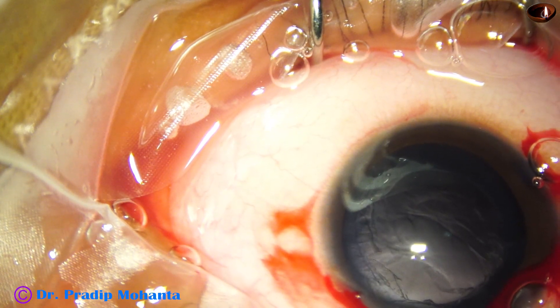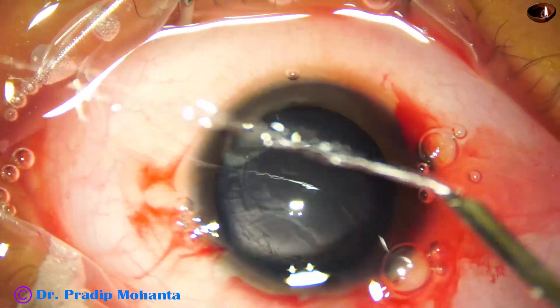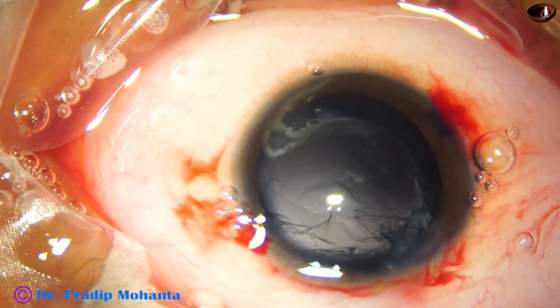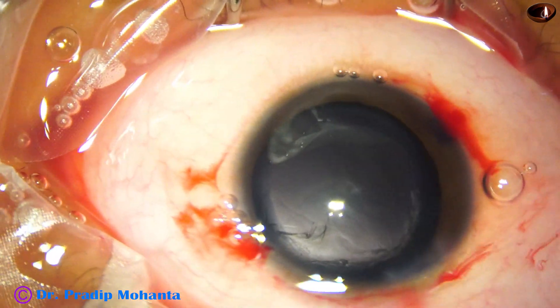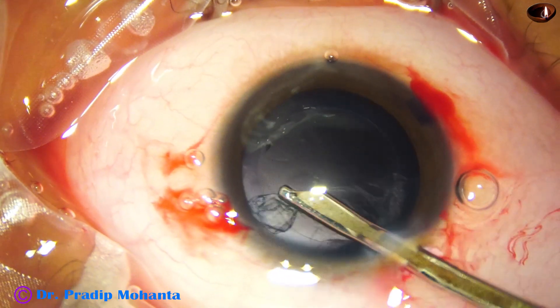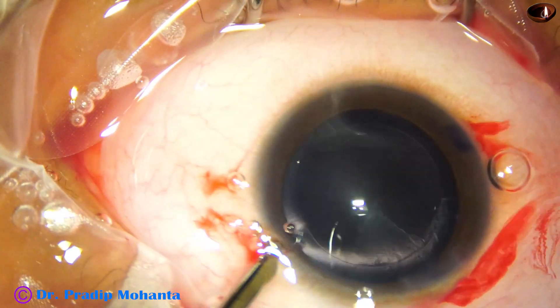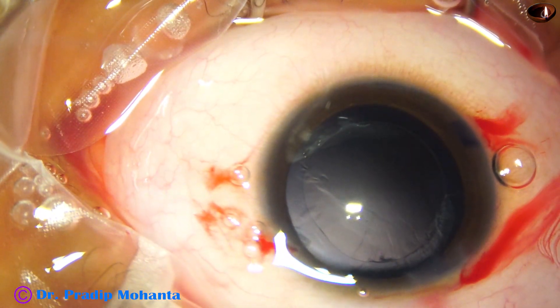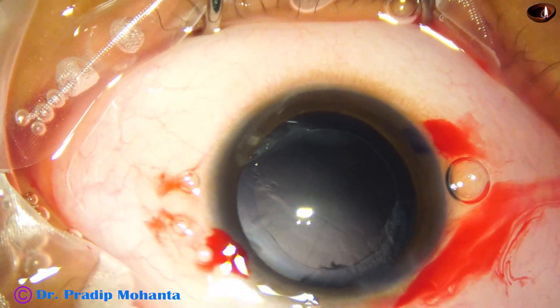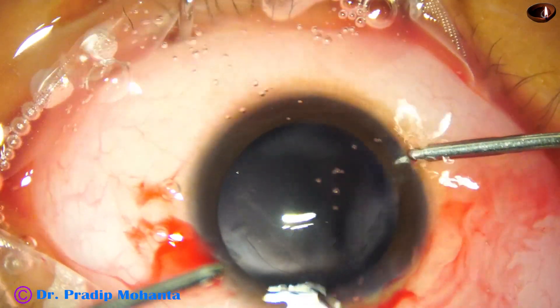I am using a 23G Simcoe cannula to remove the cortex. At this moment I have changed the Simcoe. Sometimes the cortex is such that you cannot aspirate it — you just have to hold it, come out, and flush it out.